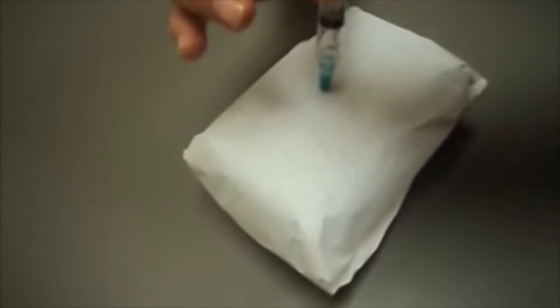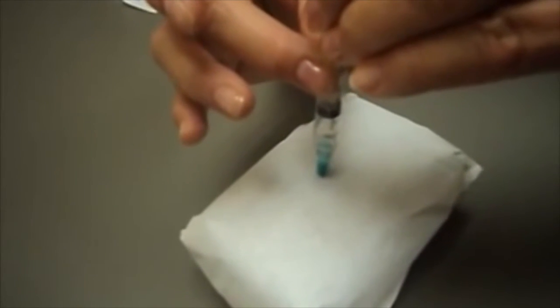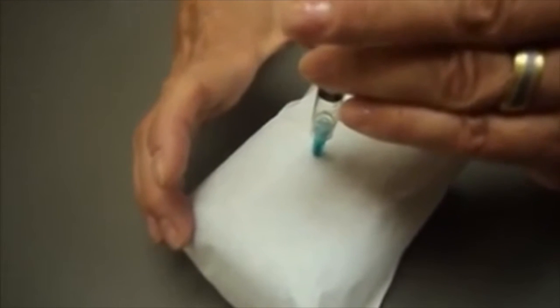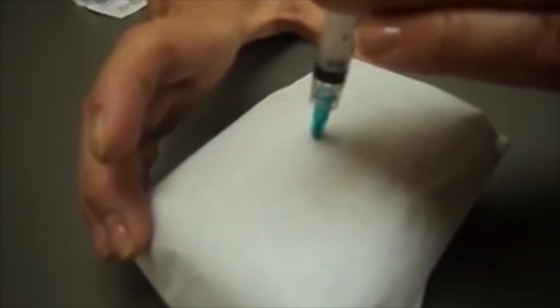You can take the other hand, hold it while you pull back to make sure any blood does not enter the syringe. If you see that blood does not enter the syringe, you go back and you inject the medication slowly, evenly. This is displacing skin, so I try not to do it too quickly because they may feel it more. And when you're done, you want to withdraw the needle quickly. If there's any bleeding, you can hold a cotton ball over the site for a few minutes. And then if there's still some bleeding, you can apply a Band-Aid.